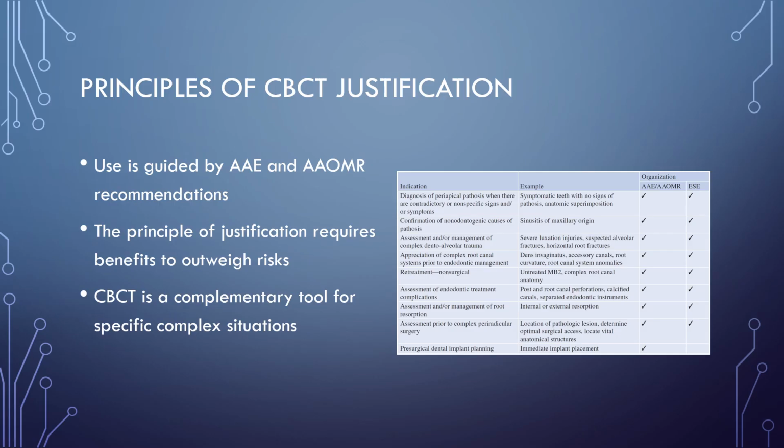There must be a clear clinical expectation that the 3D volume will provide vital information unobtainable from conventional 2D radiography, and that this new information will meaningfully impact your treatment plan or the patient's prognosis. CBCT is a highly specialized complementary tool reserved for specific and complex clinical situations, and it should never replace standard intraoral radiography for routine, uncomplicated cases.